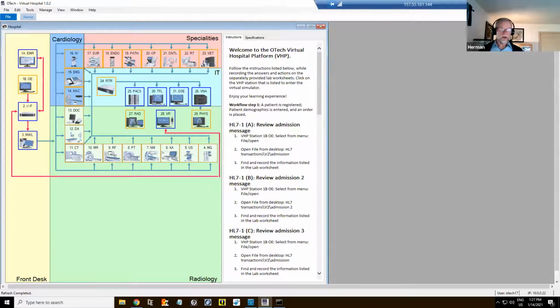If you look at the virtual hospital configuration, I have an EMR simulator and an order entry simulator. I can send to an interface engine, a modality worklist provider, and then send my query, my CT, send images through a router to the PACS and to the workstation. So I can simulate a whole department, with all the different modalities. When I click on any one of those, I can start up a simulator. Some of those are in a different virtual machine. It's a little hard to see, but everything in yellow is in the same virtual machine.